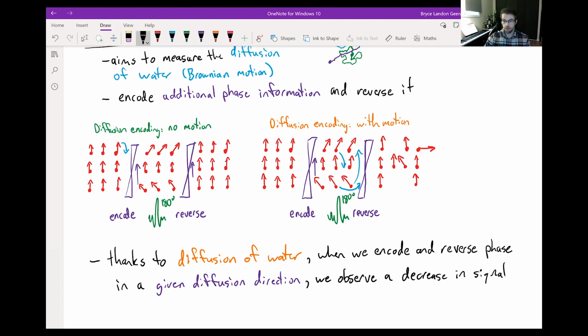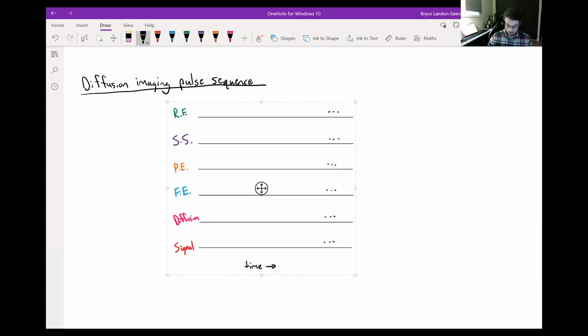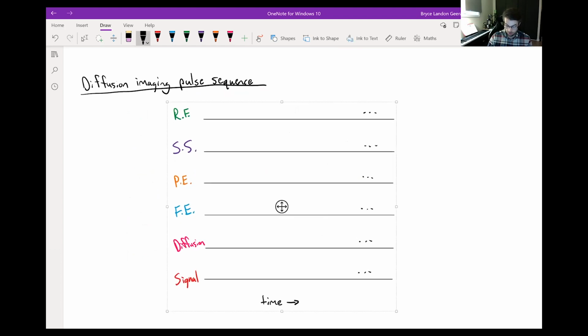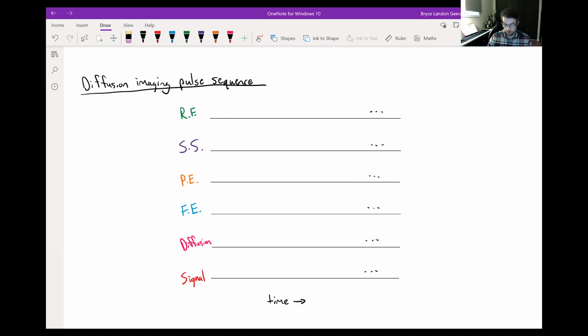So in terms of how this looks in a pulse sequence, we'll dig into that before we talk about these phase encoding details in greater detail. I'll keep that the same size. For the record, this is the only pulse sequence that I've got planned today, just to give you guys a refresher on spin echo, which is relevant for diffusion-weighted MRI. The other ones we could talk about, or we could break down fMRI and ASL. I figured it might take too much time.